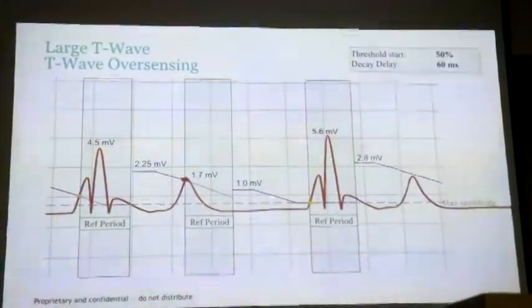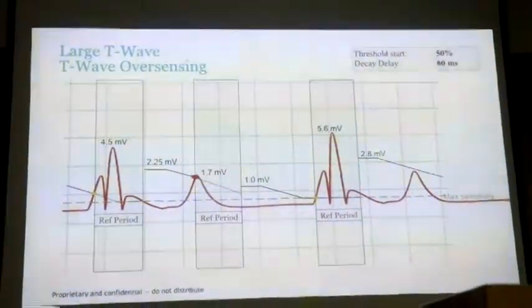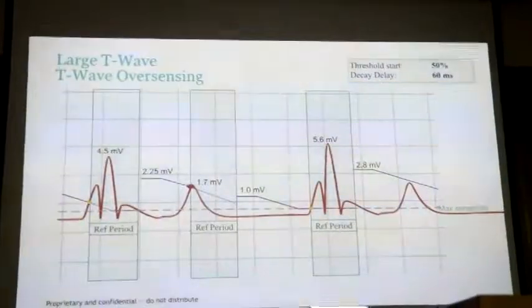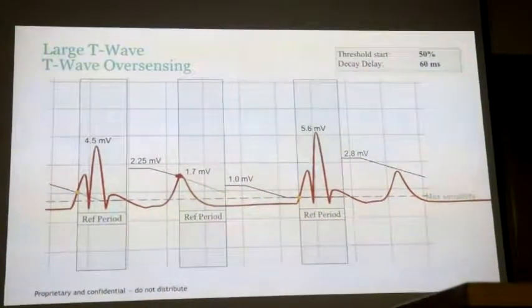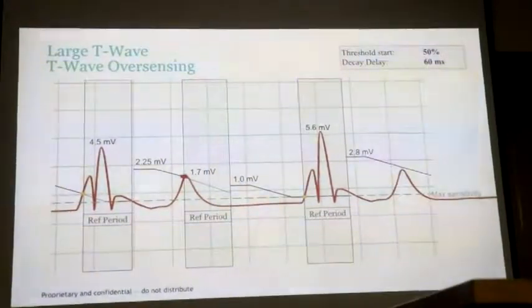It measures the T-wave, and look, it's getting more sensitive. It resets the sensitivity on here. It's skipped over the top. Okay, so you can see the small R wave, of course, the T-wave. Not the actual, not per se the size of the T-wave.